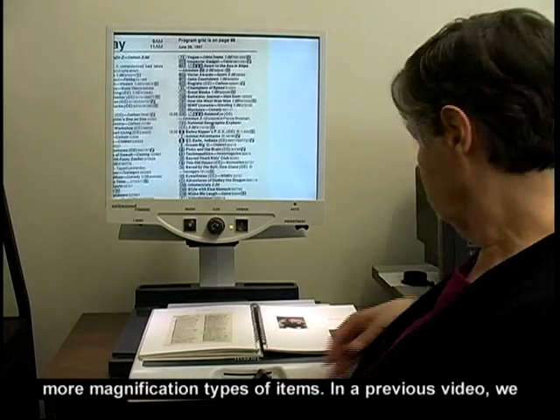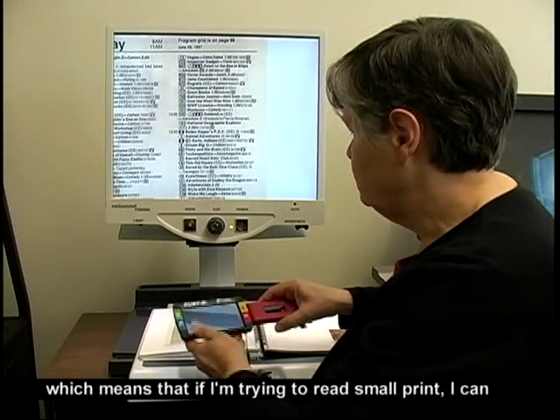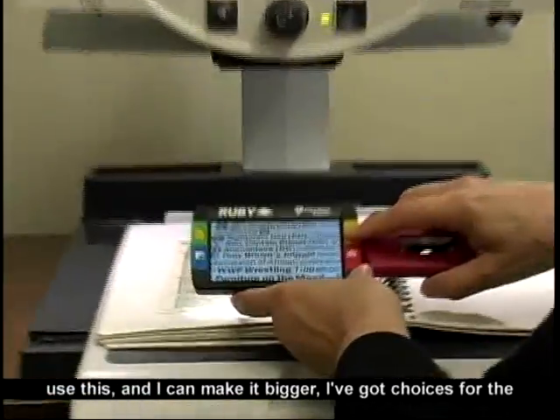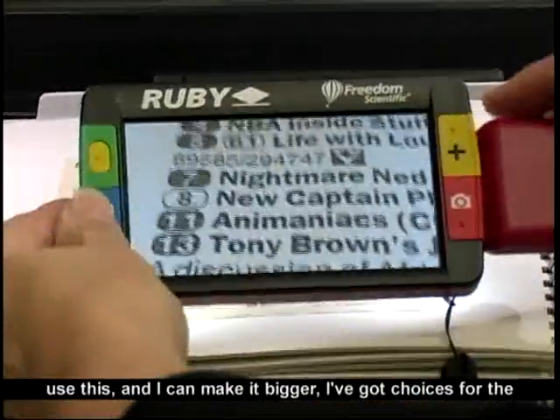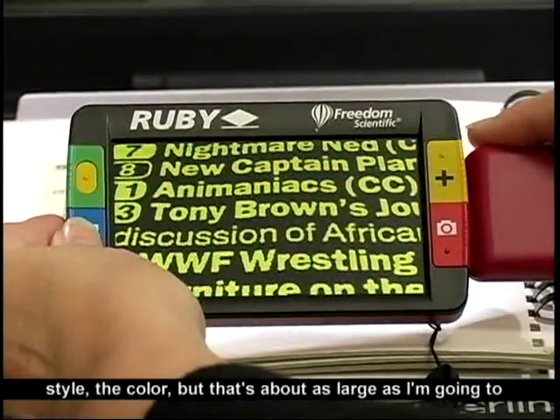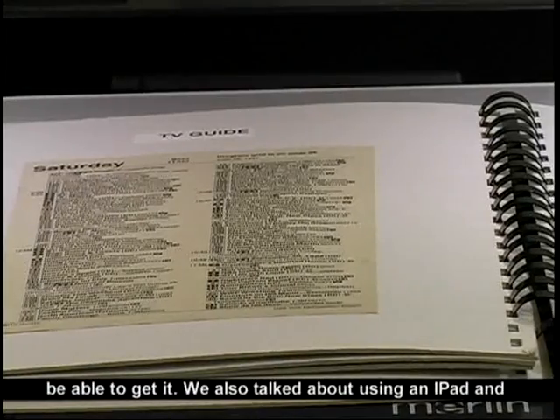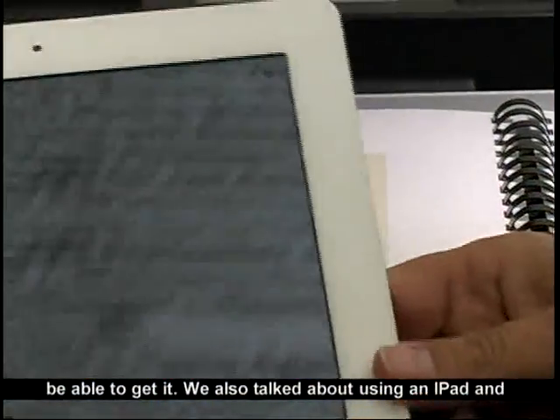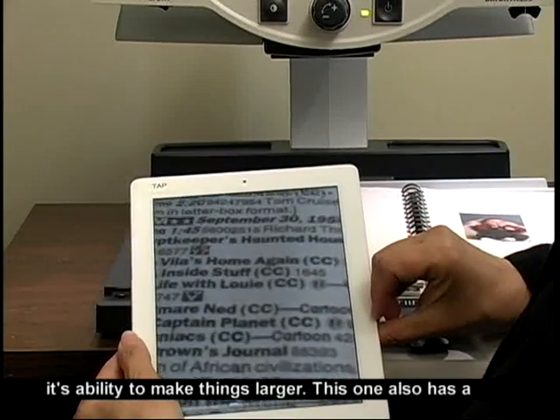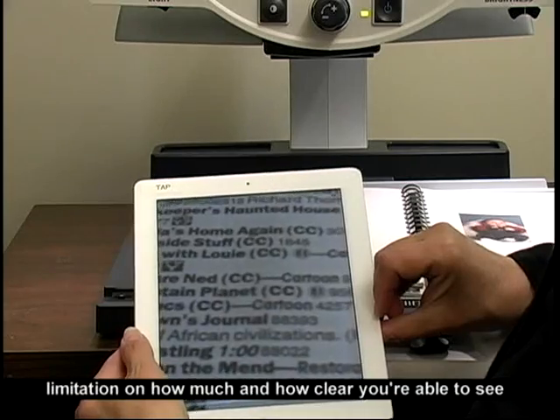In a previous video, we looked at the Ruby, which is a handheld magnifier. If I'm trying to read small print, I can use this and make it bigger. I've got choices for the style and the color, but that's about as large as I'm going to be able to get it. We also talked about using an iPad and its ability to make things larger, but this one also has a limitation on how much and how clearly you're able to see with it.